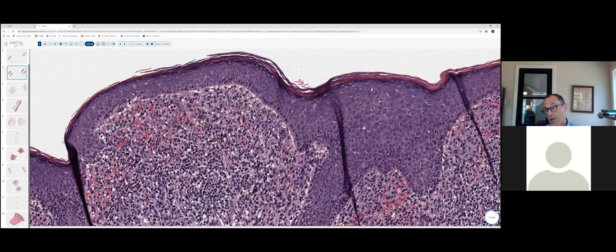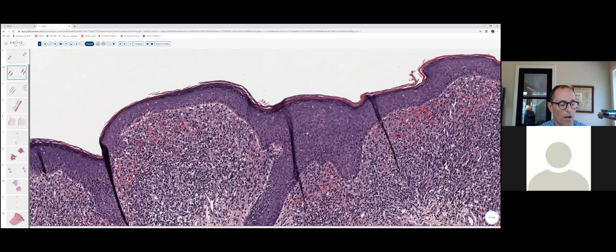And again, I realize that this biopsy is cut a little thick. It's kind of hard to assess the size of the particulate material. That being said, the old adage: where there's smoke, there's fire. So with a lot of extravasated red blood cells, this pigment is much more likely to be hemosiderin than melanin pigment. And indeed, this did highlight with a Perls' iron stain. So what we have here is lichenoid purpura, which is one of the chronic pigmented purpuric dermatoses.